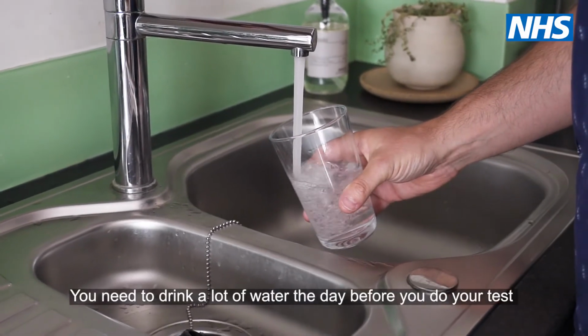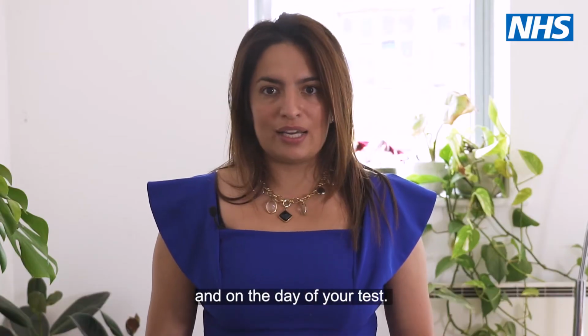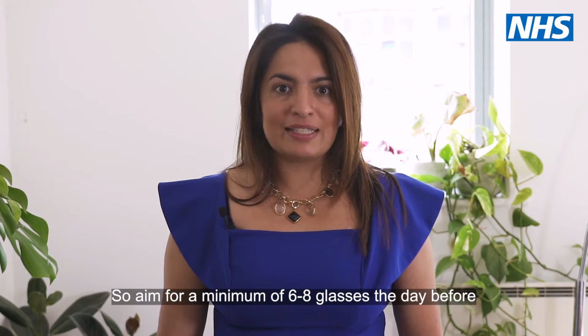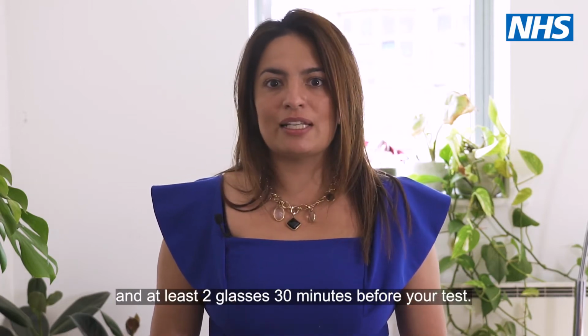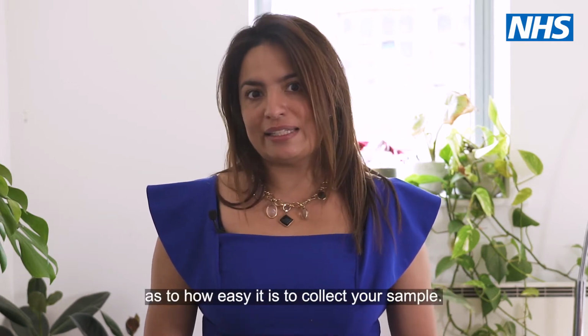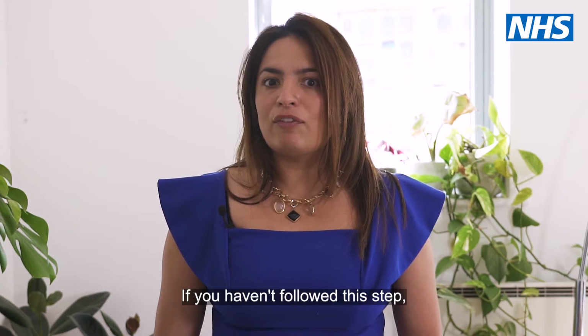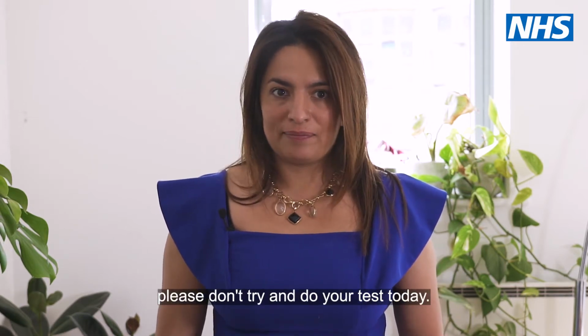You need to drink a lot of water the day before you do the test and on the day of the test. So aim for a minimum of 6 to 8 glasses the day before and at least 2 glasses 30 minutes before your test. This will make a really big difference as to how easy it is to collect your sample. If you haven't followed this step, please don't try to do this test today.